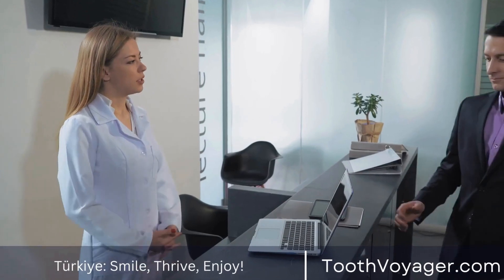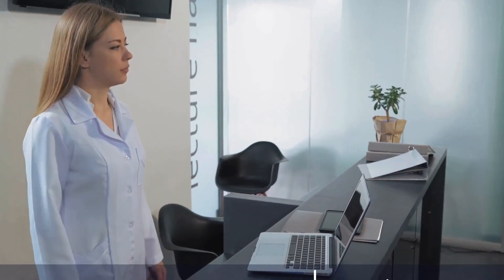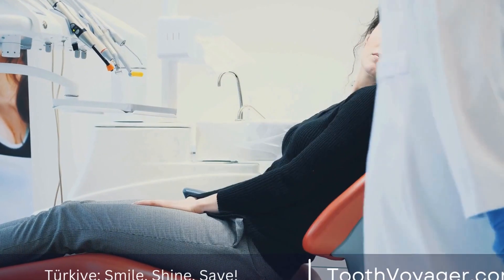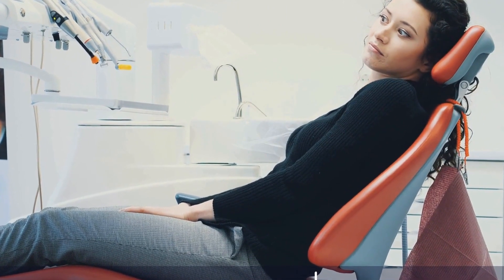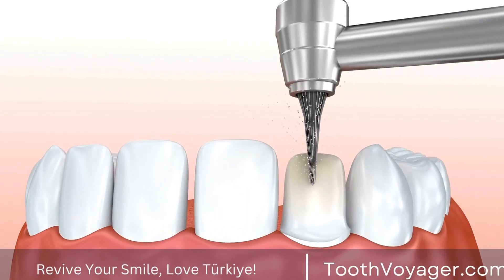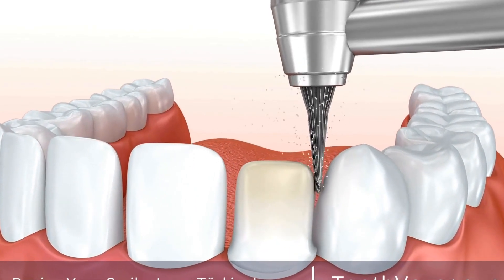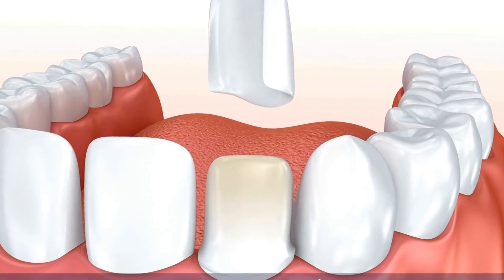There are several types of dental bridges, including traditional bridges, cantilever bridges, and Maryland bridges. Traditional bridges are the most common type and involve the placement of crowns on the teeth on either side of the gap, with the pontic attached in between. Cantilever bridges are used when there is only one adjacent tooth to the gap, and Maryland bridges involve the use of a metal or porcelain framework that is bonded to the back of the adjacent teeth.